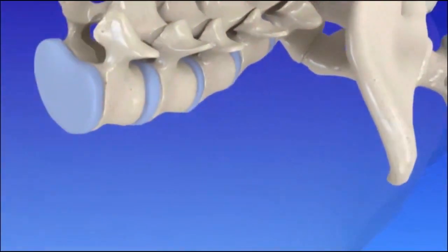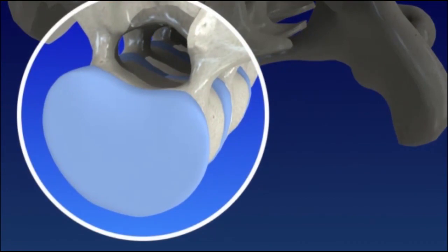Your doctor will use a live X-ray to carefully insert and guide a needle to the outer layer of the suspected disc. Next, a second needle is moved through the first one and guided to the center of the disc. If more than one disc is suspected, the process is repeated.